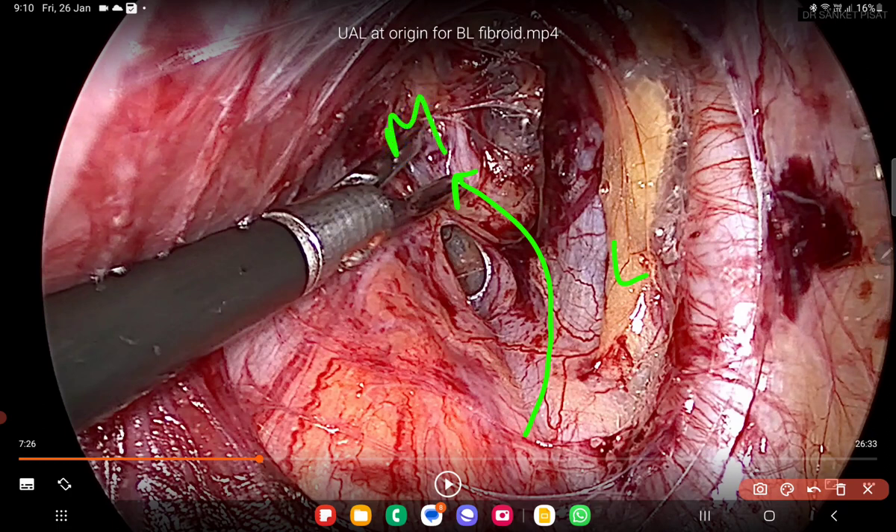In the lateral pararectal space we are trying to find the uterine artery. The uterine artery is the first vessel that crosses the pararectal space from the lateral to the medial side — there is no other structure that does this. So this is the easiest and most consistent way to identify the uterine artery: look for a structure that crosses from lateral to medial, lateral to the ureter.